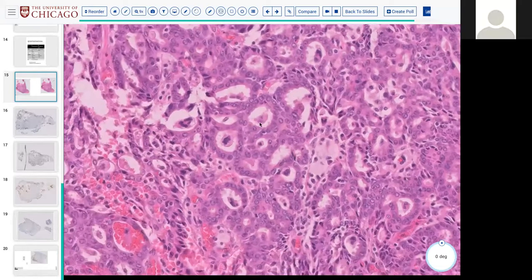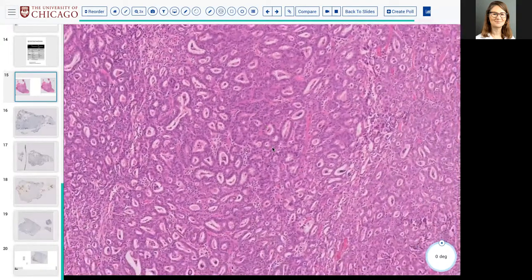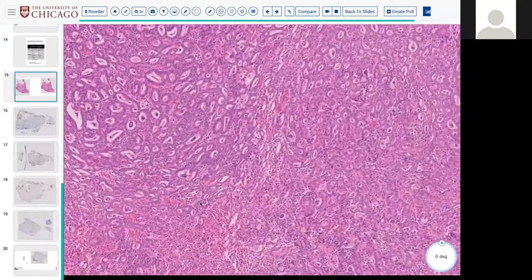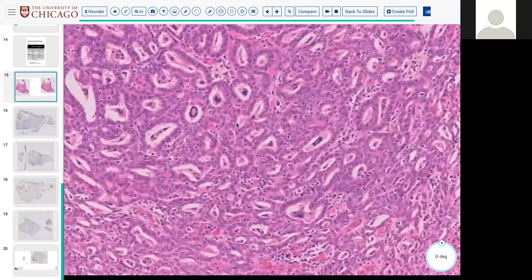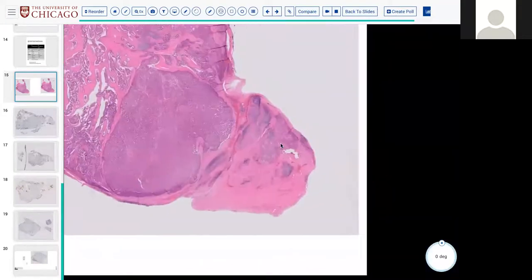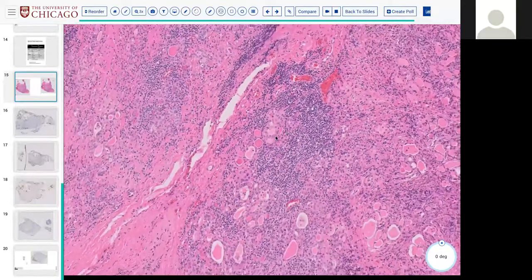And this isn't cribriforming, right? It's perhaps not exactly cribriforming, but you can definitely perceive a suggestion of some subtle back-to-back glands. So I would say perhaps. Okay, I see there's a bunch of stains. She doesn't have a desmoid tumor or something. She doesn't have a desmoid, but that doesn't mean she can't. This is totally intrathyroidal. Here's the background thyroid with some inflammation and almost oncocytic change.